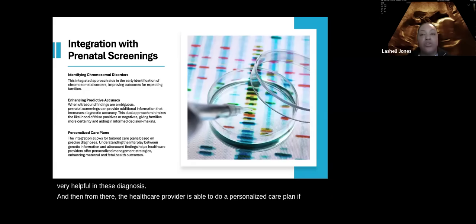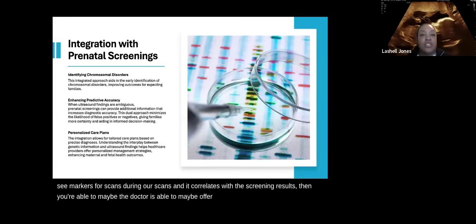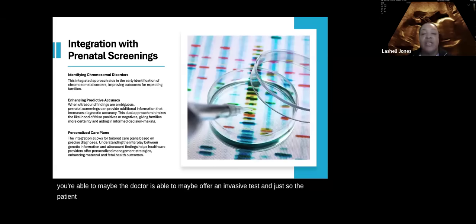If we see markers during our scans and it correlates with the screening results, the doctor is able to maybe offer invasive testing just so the patient can know for sure. So it's really becoming a combination tool to use during prenatal care.